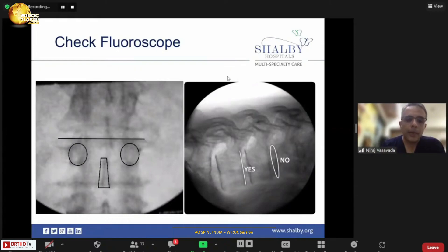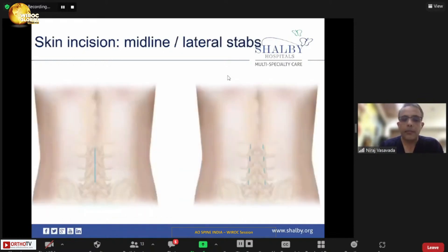Make sure that you have a true AP and a true lateral view of your spine. We call it the owl sign — two nicely looking owls with the center point being the spinous process, and you have a crisp, sharp end plate of the vertebra where you are inserting the pedicle screw. Never accept an oblique vertebra view while putting the pedicle screw, because if you are reaching the inferior or superior margin of your pedicle, an oblique view will not give a proper picture.